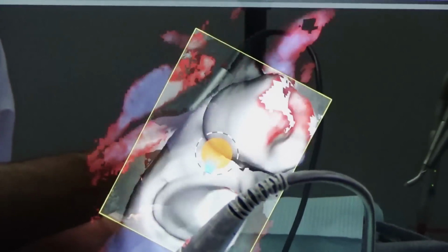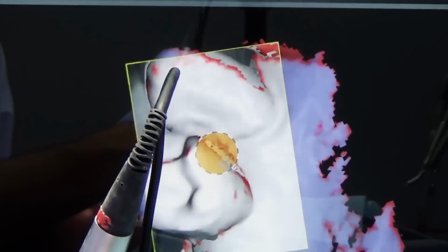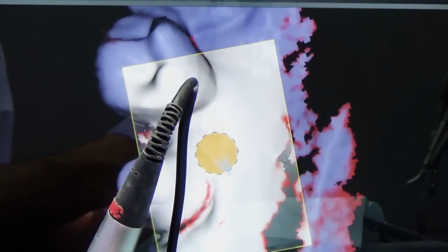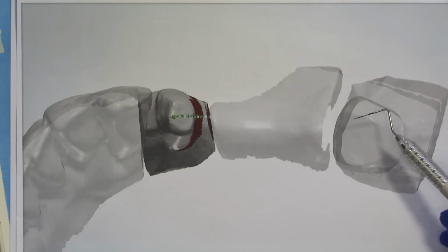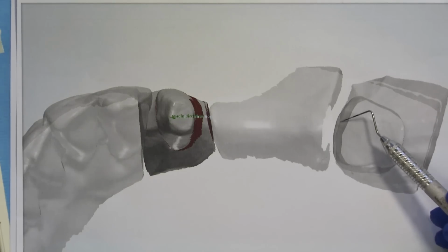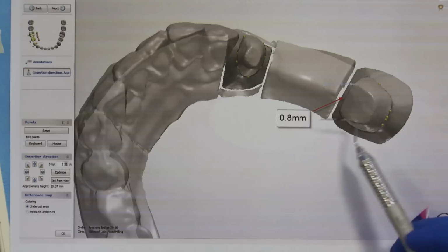The lab always suggests that we reprep and reimpress, but who wants to bring the patient in for another appointment? What you can do is to digitally capture the preps and send it via internet to the lab for evaluation. The lab can use their digital design software and send you back an image like this almost within minutes, indicating the location and the amount of the adjustment before taking the final impression.